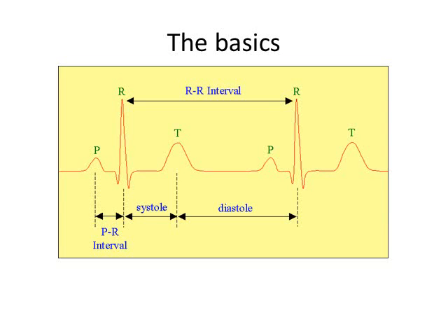And that just shows systole and diastole. So diastole occurs between T and R, and systole between R and T.